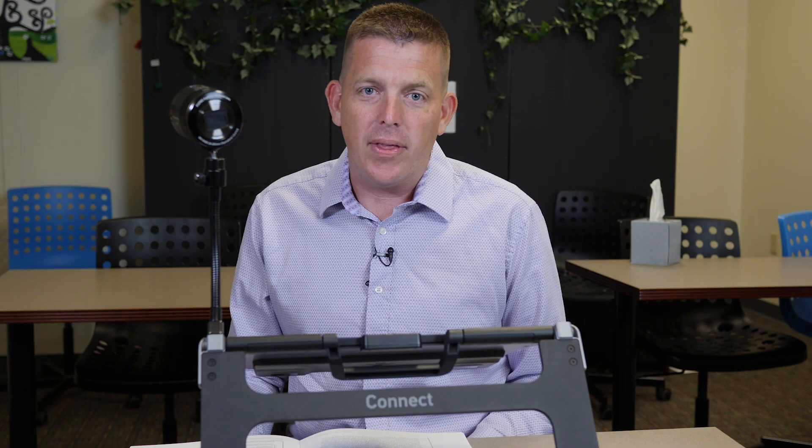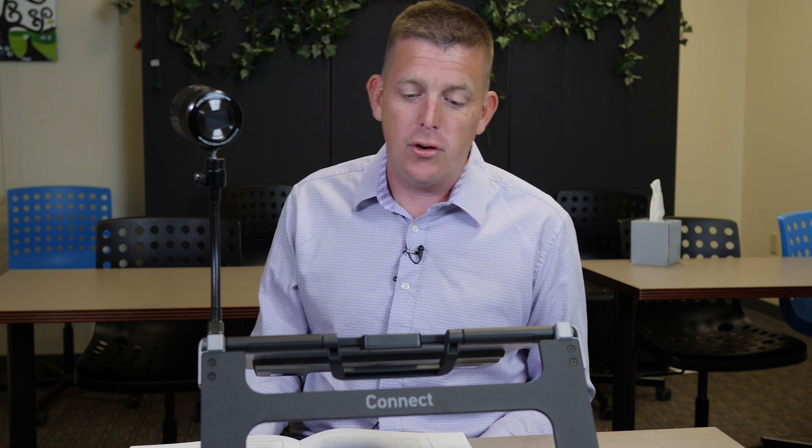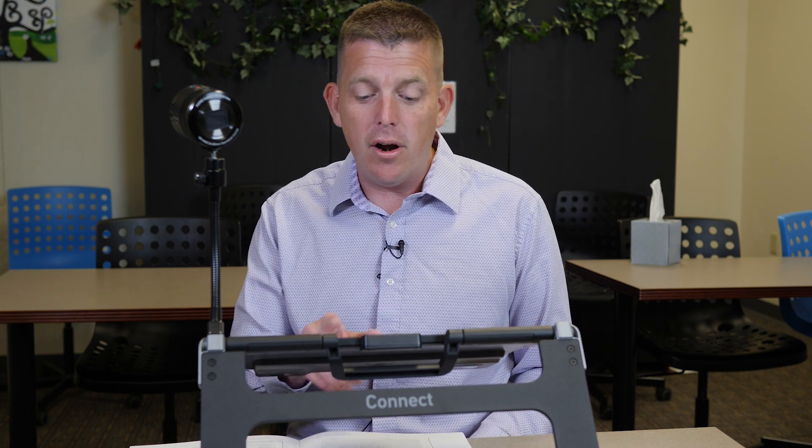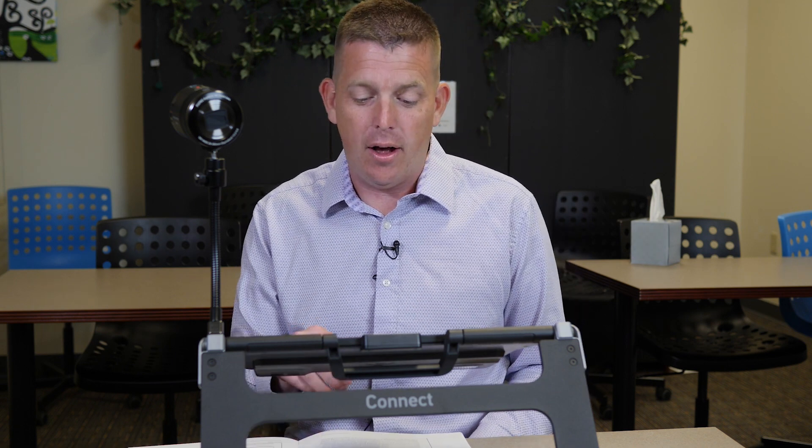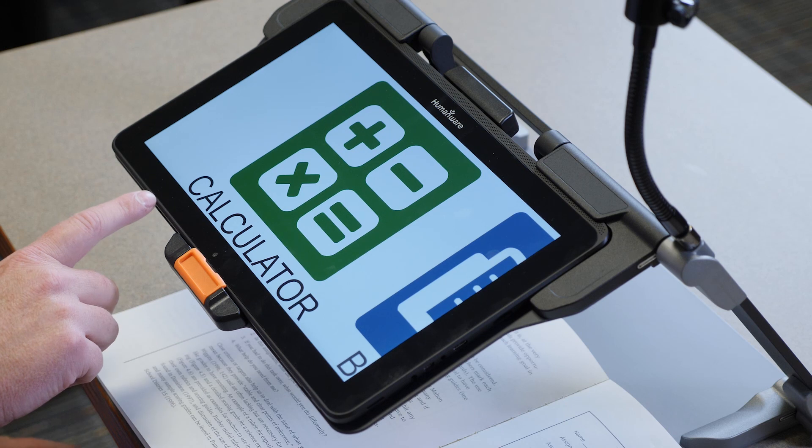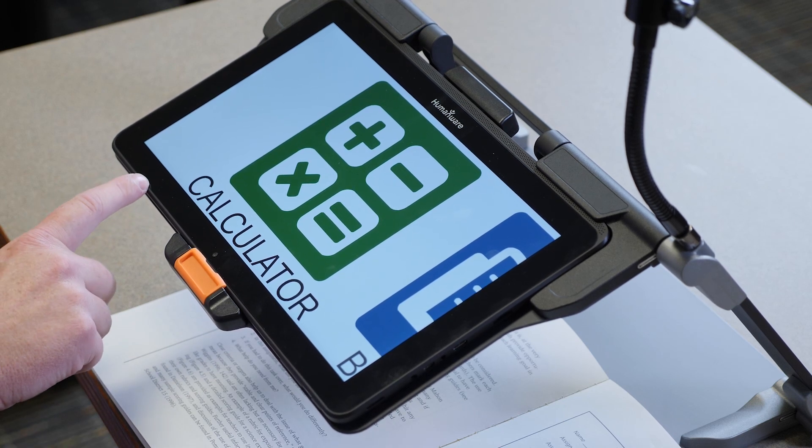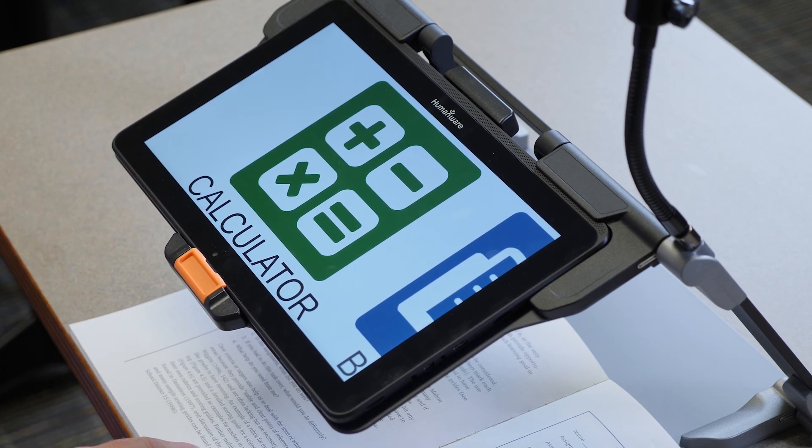Today I'm going to talk to you about the Prodigy Connect 12 by HumanWare. It's a full Android tablet as a solution for your low vision students. When you turn it on, it starts with a carousel. The carousel allows you to access different applications built for the Prodigy.